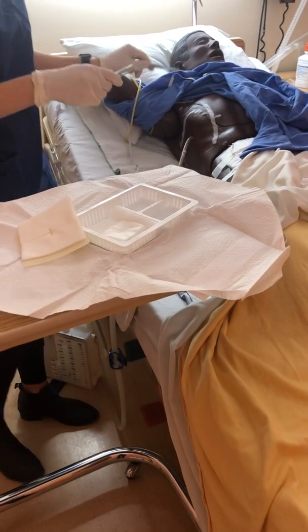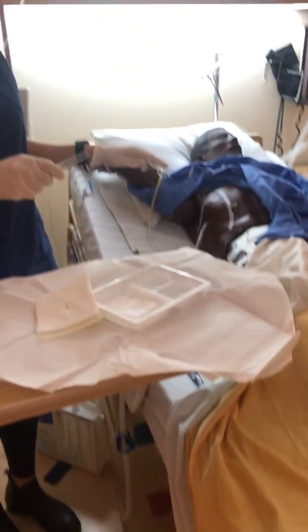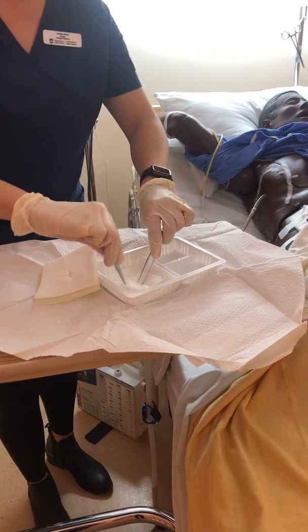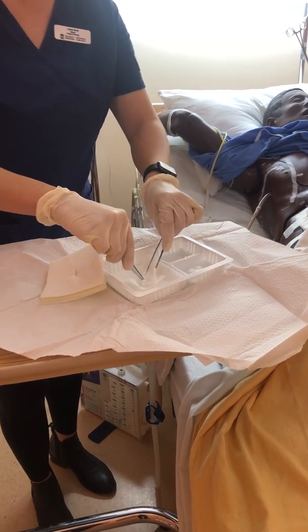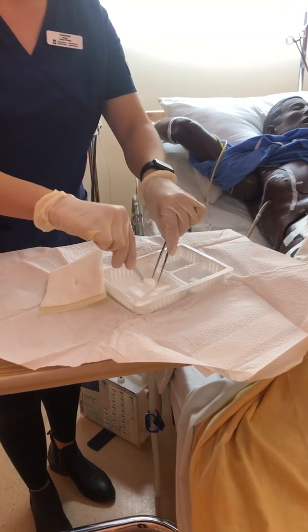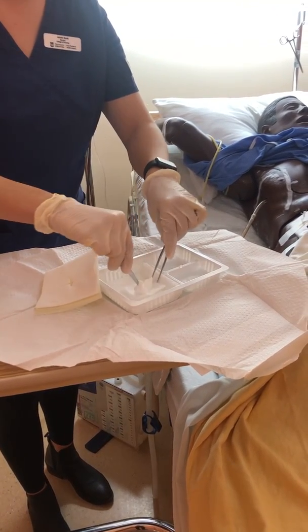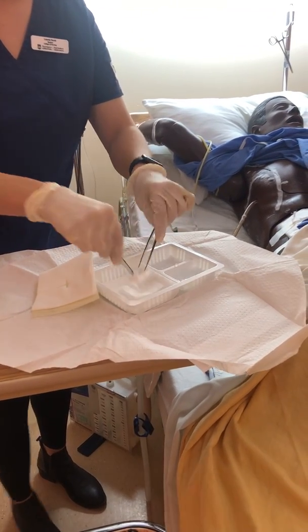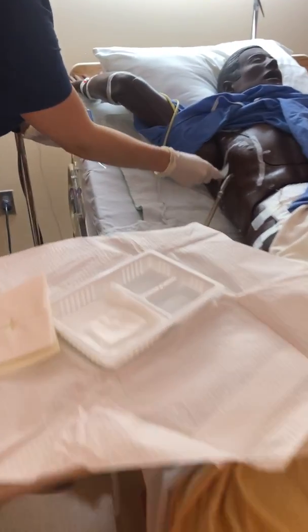Good, so I'd want to clean the skin around the whole part that'll be occluded by the dressing, which I have, so now it's time to dry. So I'll take another dry rosette here. Oops. And start by going, again, closest to the site, 1 swipe per wipe, around.